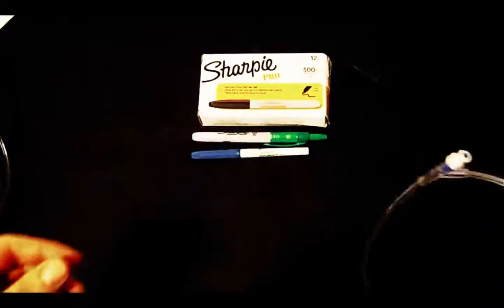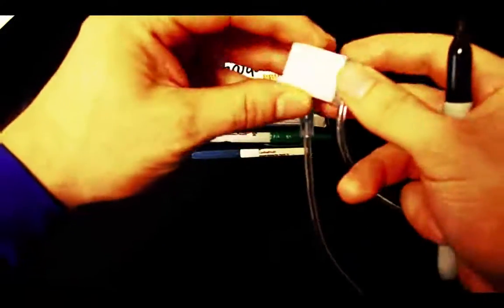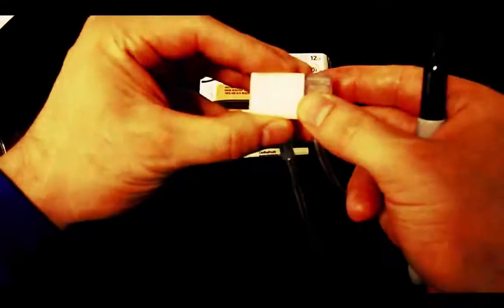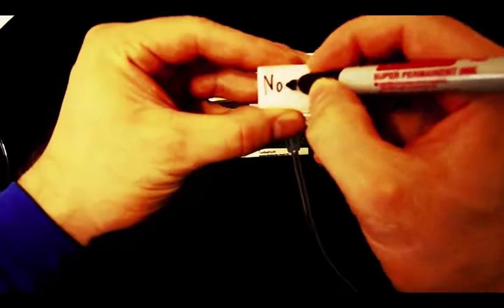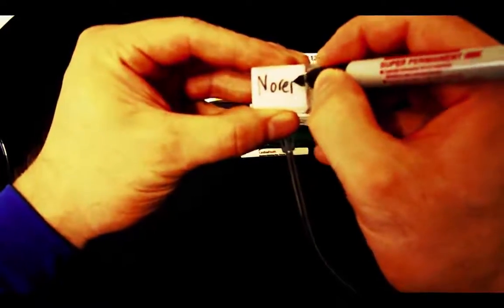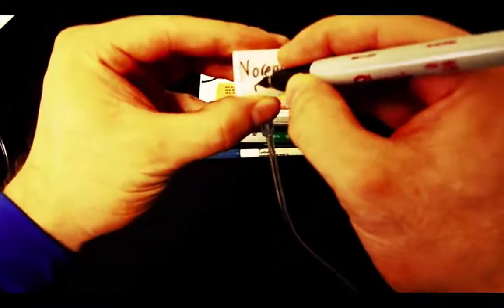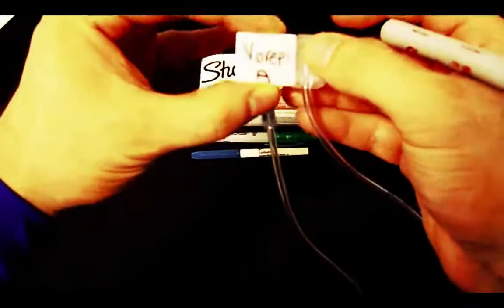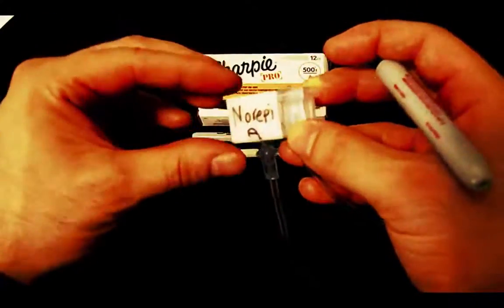I also like to mark the cassettes on my Laris pump. I would write the medication name — for example, 'norepinephrine' — and if it applies to channel A, I'll put 'channel A,' or B, or whatever it may be. This way you know exactly what medication is on each channel with no confusion.